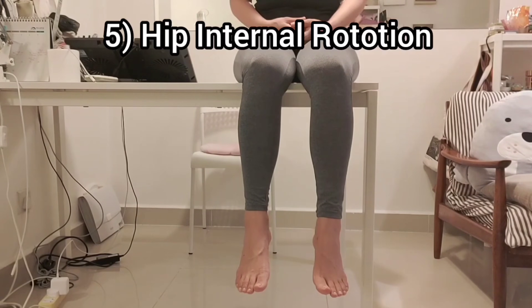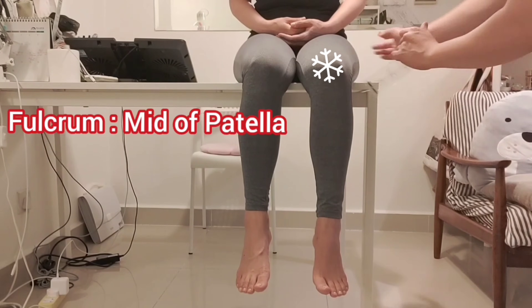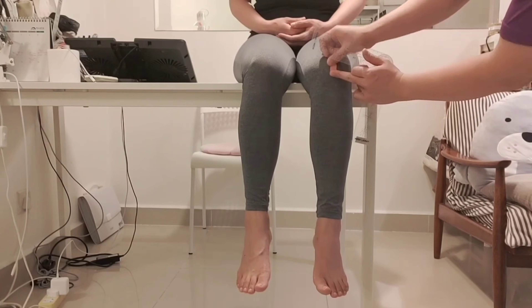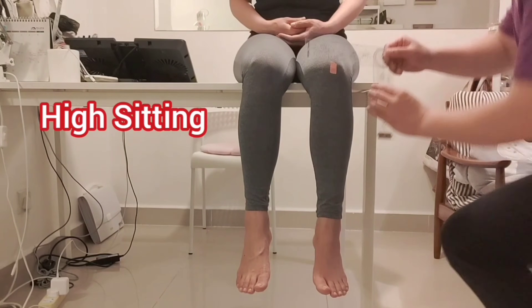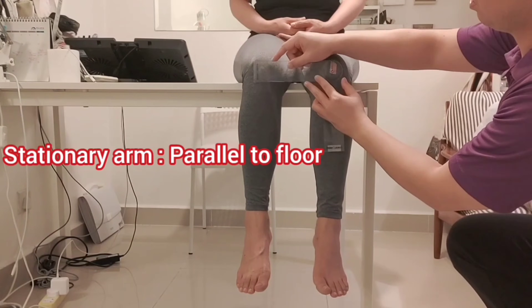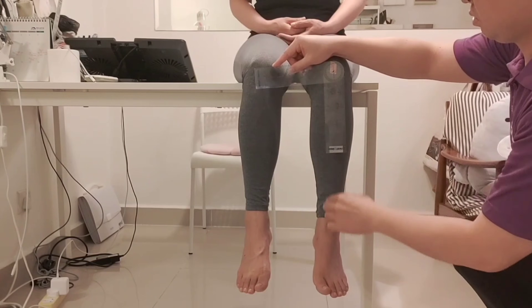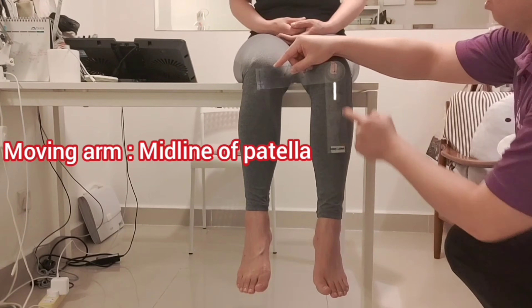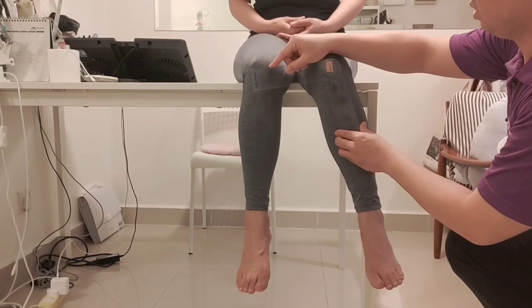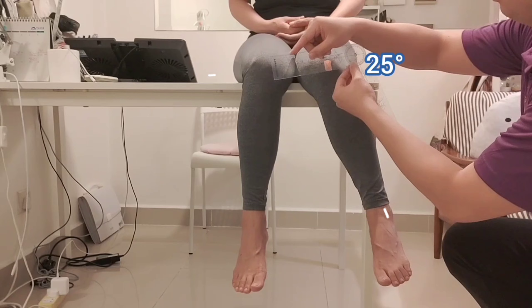Number five: range of motion of hip internal rotation. The fulcrum is the midpoint of the patella — make sure to stabilize the femur and pelvis. The patient should be in a high sitting position. The stationary arm is parallel to the floor, starting with the goniometer at 90 degrees, and the moving arm is going to be aligned with the midline of the patella. Make sure both legs are hanging freely during the high sitting position.